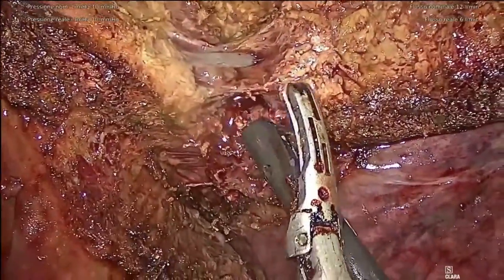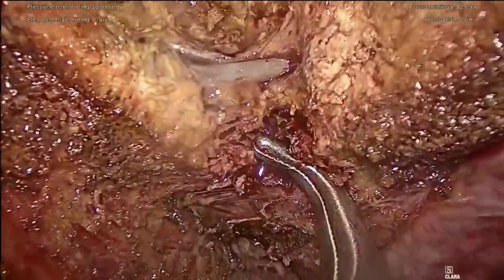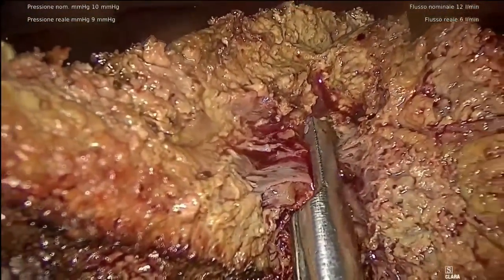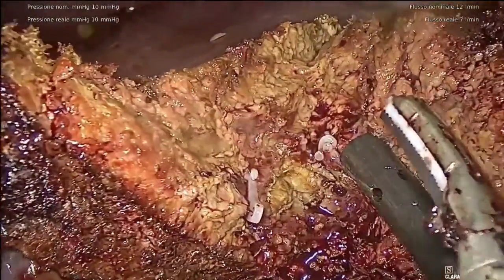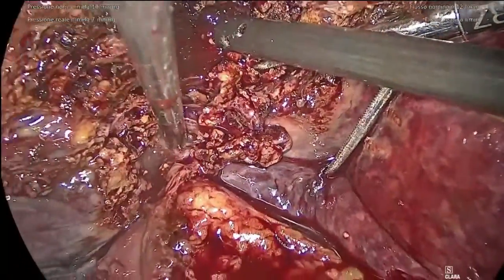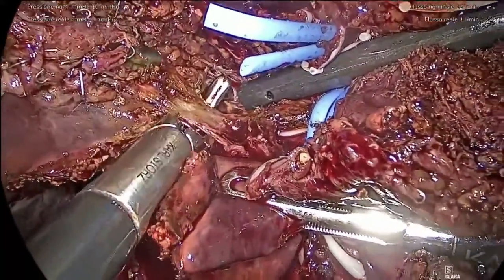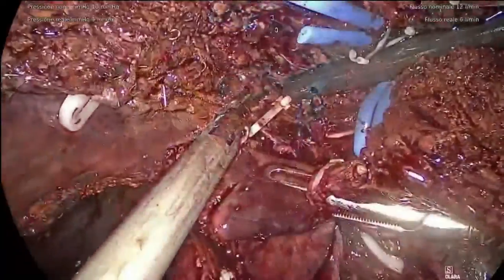After that, we start the transection. In our preoperative plan, the middle hepatic vein should be preserved and exposed on the surface of the remnant liver. After the resection of the Spigelian lobe, the right hepatic duct is identified, isolated, and ligated between clips.